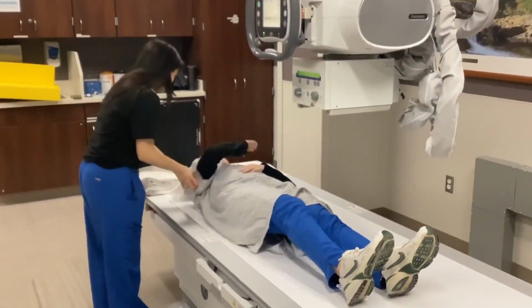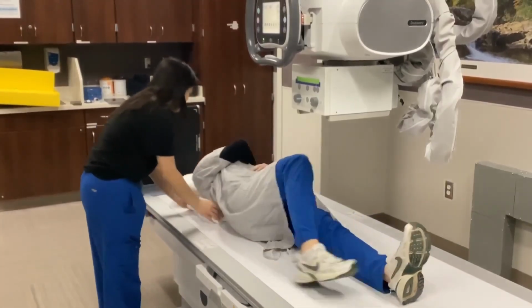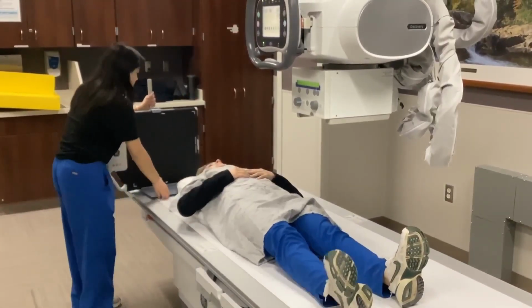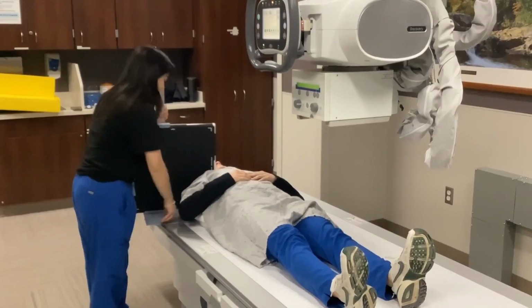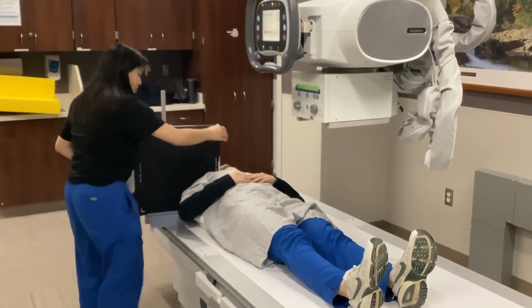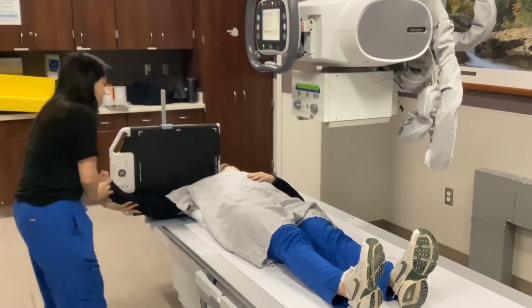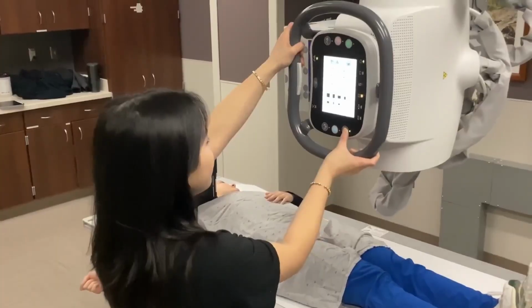The patient is positioned supine, where you'll have them roll away from the affected side to place a towel underneath the affected shoulder. This will allow for a better visualization of the shoulder joint on the x-ray. We'll then place the IR behind the shoulder and have the patient roll their head away from the affected side, abducting their arm 90 degrees.